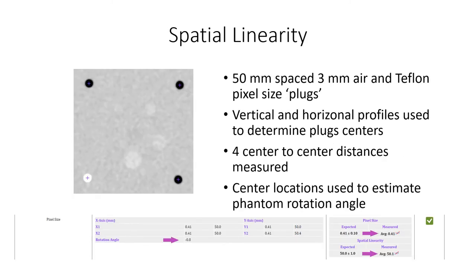For the spatial linearity evaluation, two measurements are reported: pixel size and the measured average distances between the four pixel size test plugs. The pixel size plugs are used for verification of the expected pixel size as stored in the DICOM tag for pixel spacing. The center locations of the pixel size plugs are determined from a center of mass calculation of a vertical and horizontal profile through the target plugs. The center-to-center distances are reported as spatial linearity.